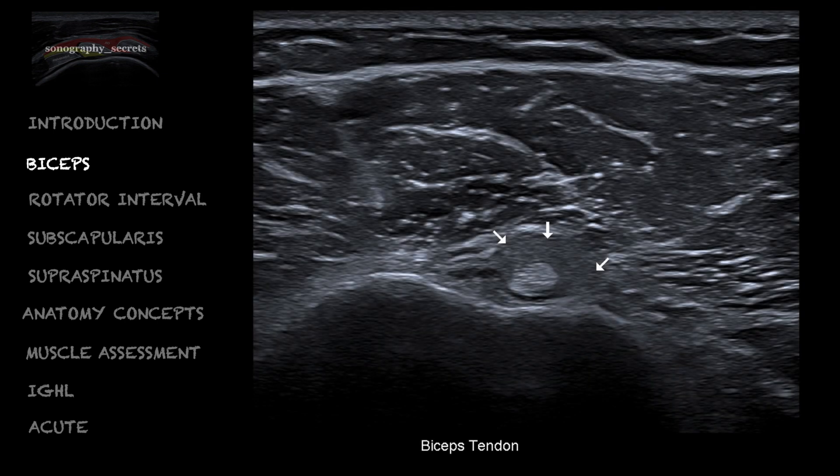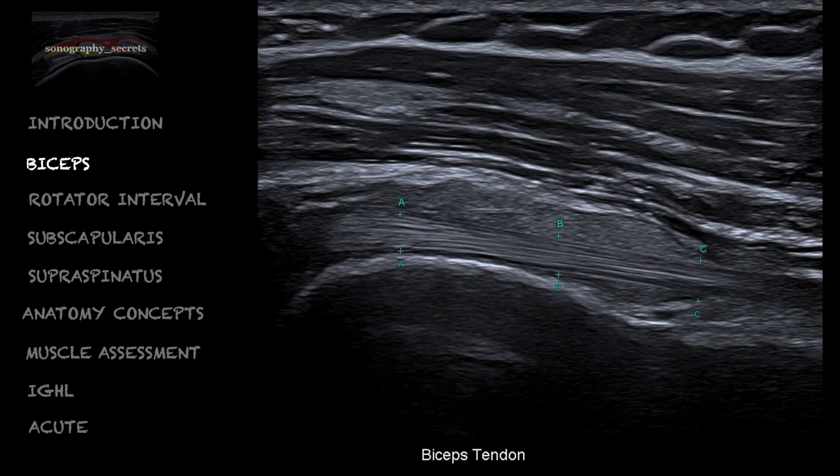Lastly, we can see echogenic fluid or blood within the long head of the biceps sheath — a hemarthrosis post-trauma. Once we see this, our approach to the scan immediately changes to one in which we are simply looking for the presence of a fracture.